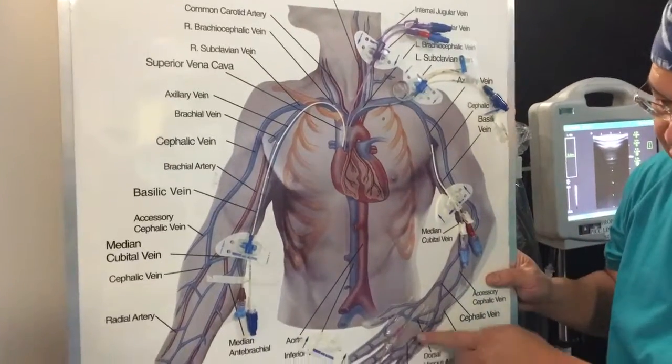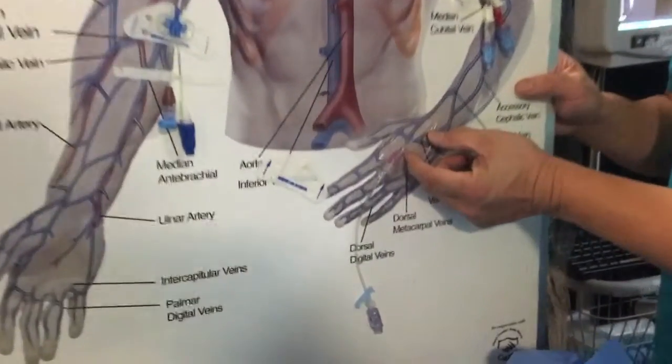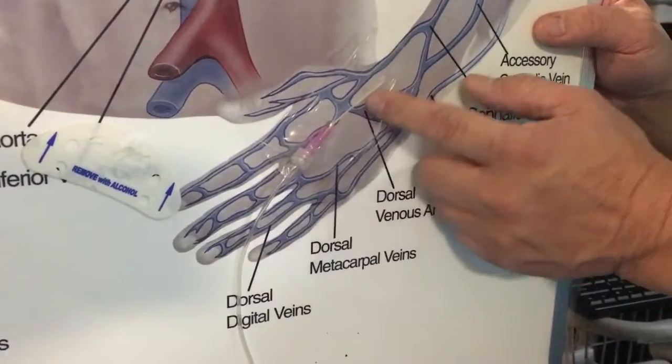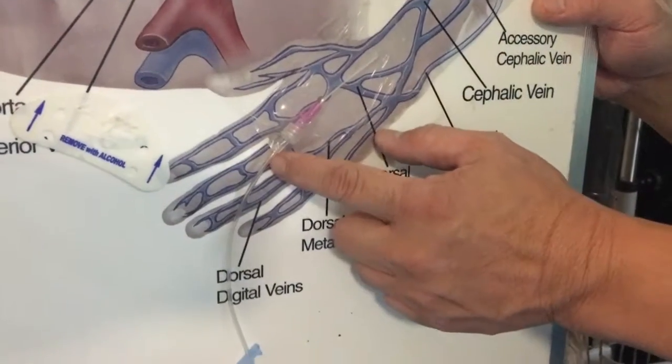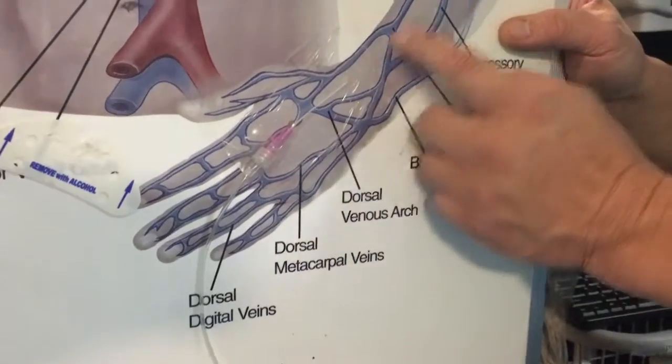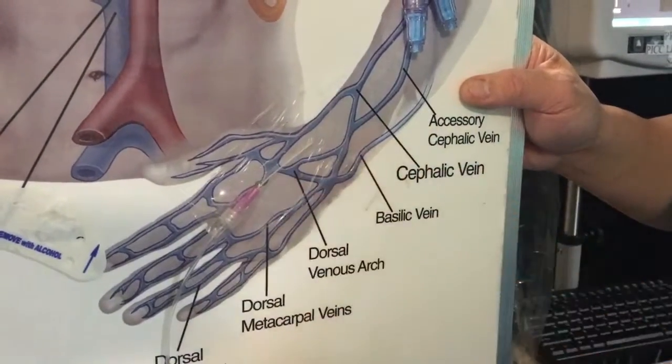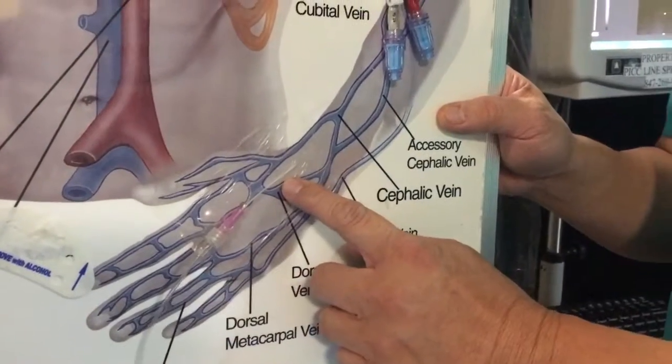First, you have your 1 inch to 2 inches catheter in a vein that's usually in a hand or on the lower arm, which is called a peripheral IV. So that's your basic IVs.